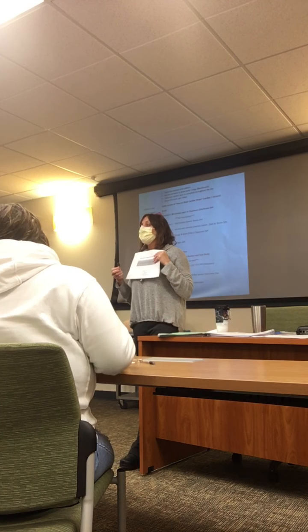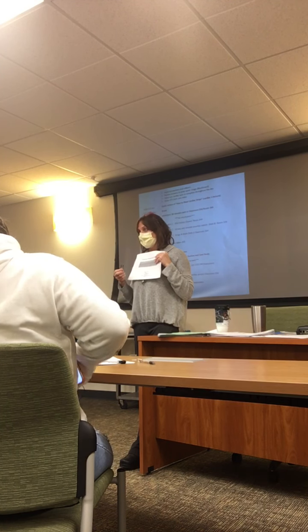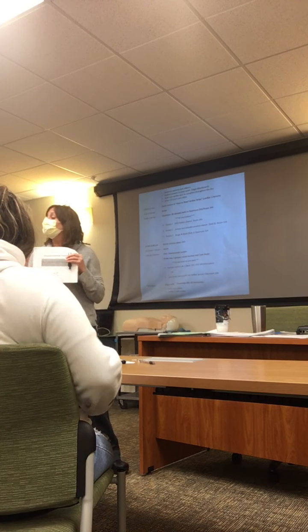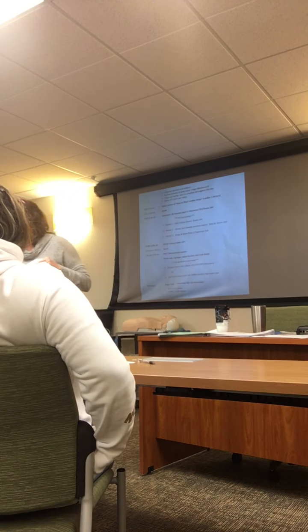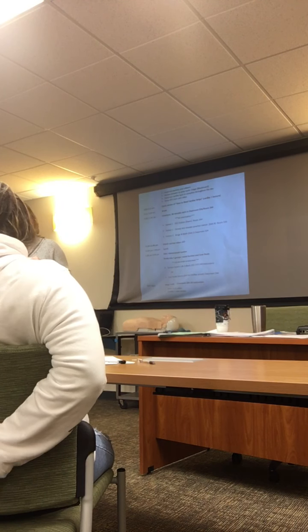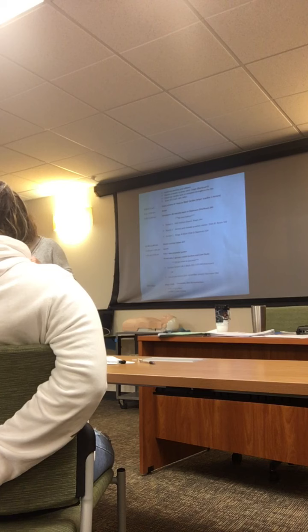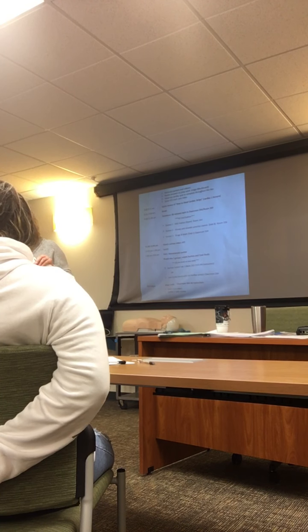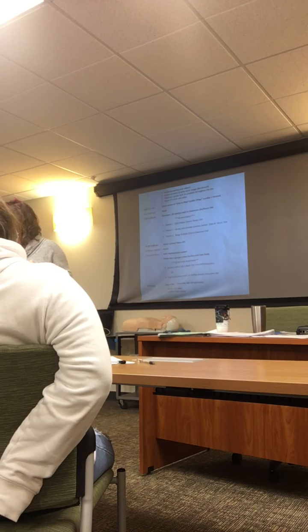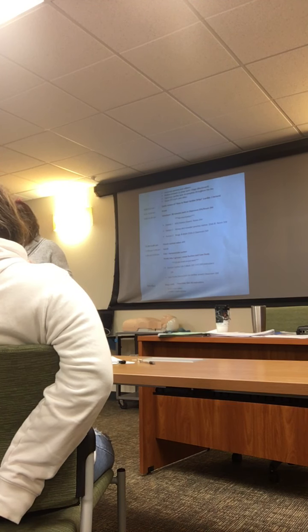Yeah, so to count the rate on this one, you're not counting the PVCs? Good counting question, because I would count it if I was looking at the monitor and taking Marissa's pulse and I felt it. You'd feel it. Has anybody ever felt someone with PVCs? No. You can feel it if they perfuse, and if they perfuse, you would count it. Okay. So you can feel it in the pulse. Yes. Sometimes they perfuse, sometimes they don't. They're more dangerous if they don't.